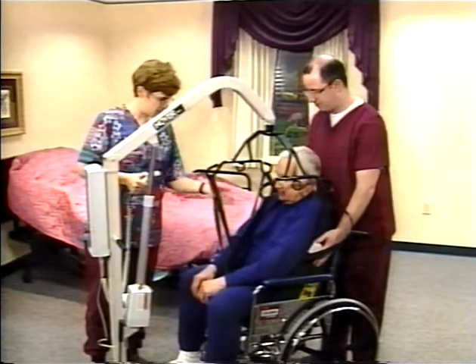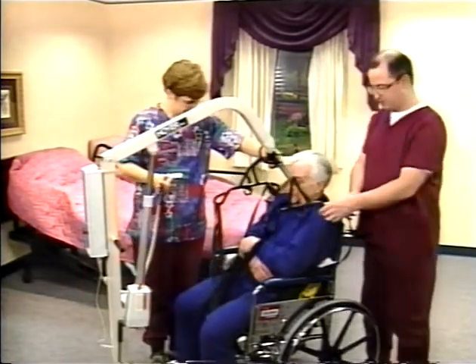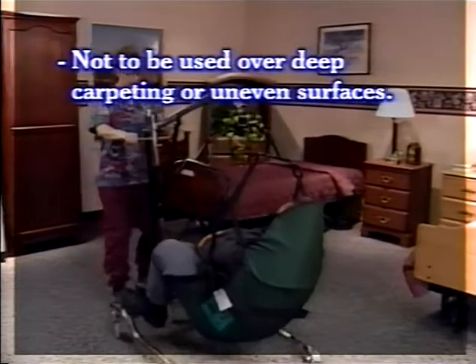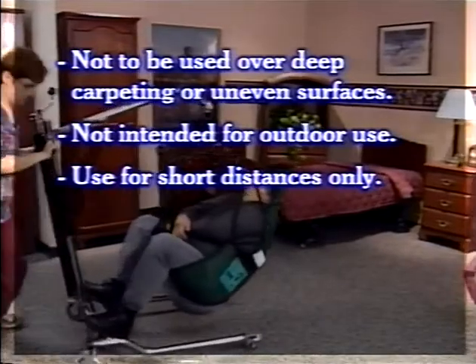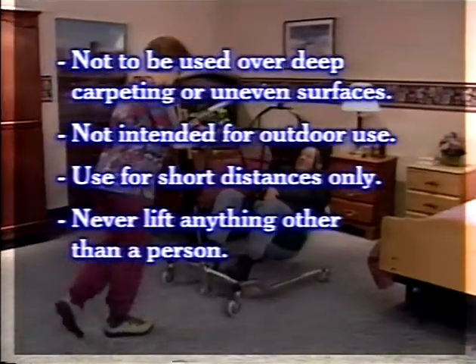Lifters are intended to take the strain and discomfort out of transfers. For longer transports, a wheelchair is a better choice. Lifters were not designed to travel over deep carpeting or uneven surfaces, nor were they intended for outdoor use. Use a lifter for traveling short distances only. Never use your lifter to lift anything other than a person.